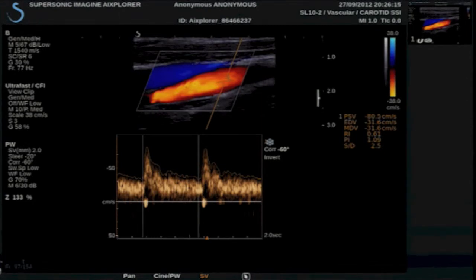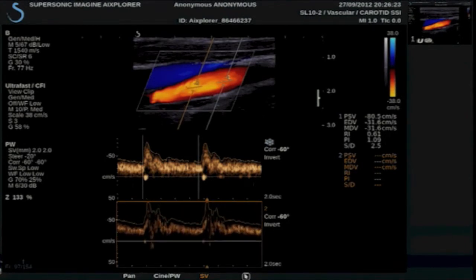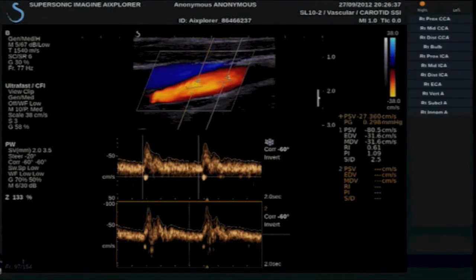I can add a second spectrogram, again deciding where I want to place this, adjusting my baseline, the gain, and the sensitivity of the autotrace. If I don't want to use the autotrace, I can manually measure this — I can go into measurement. If I want to do a straight velocity, I can also add a velocity measurement here.